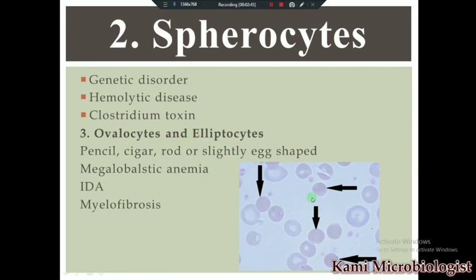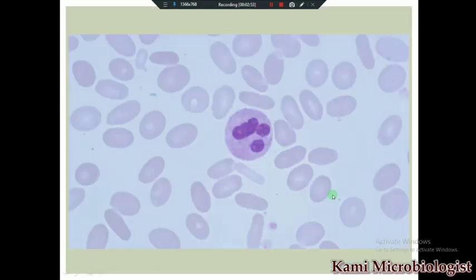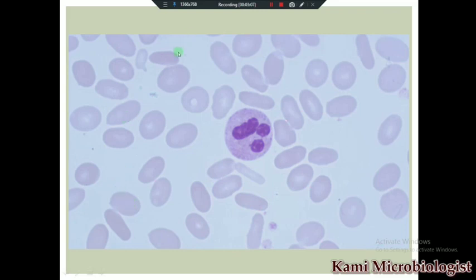Looking at the microscope images: these are the spherocytes — spherical in shape as you can see. And these are the elliptocytes — cigar-shaped. The first picture, second, and third all show elliptocytes as you can see.